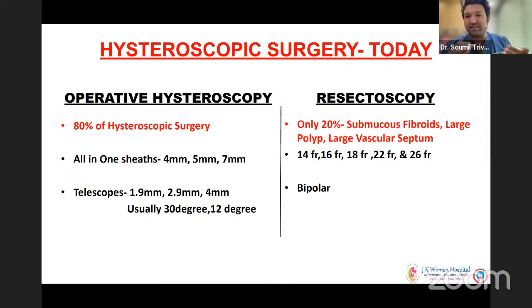Sometimes that is a challenge because it might not be adaptive in all situations. Over a period of time, you get adapted to the changing scopes. Initially, yes, there is an initial issue.